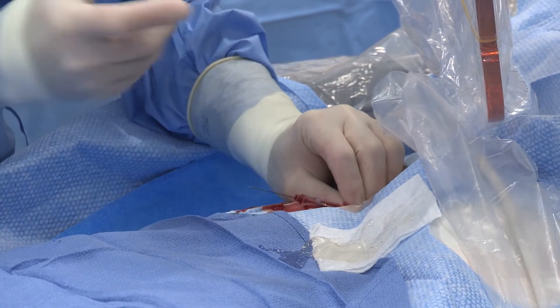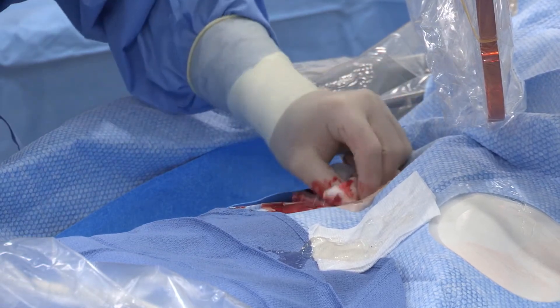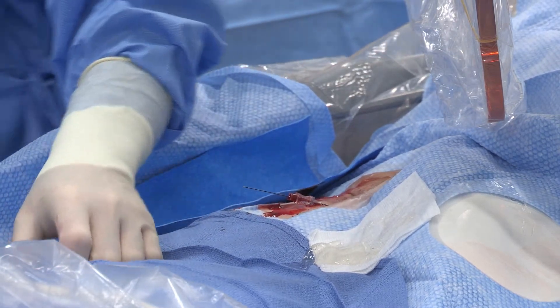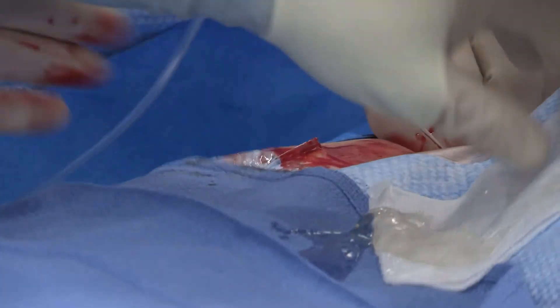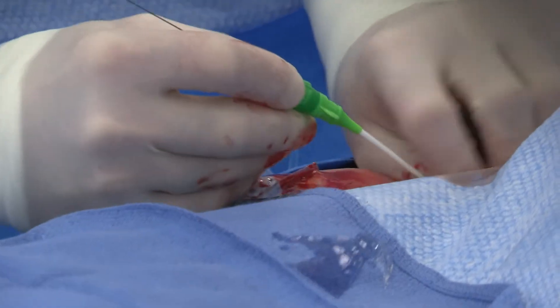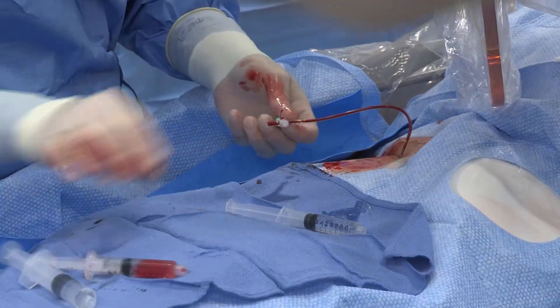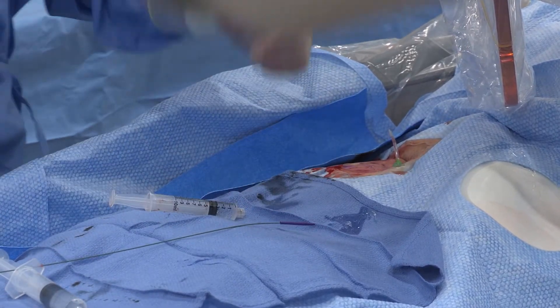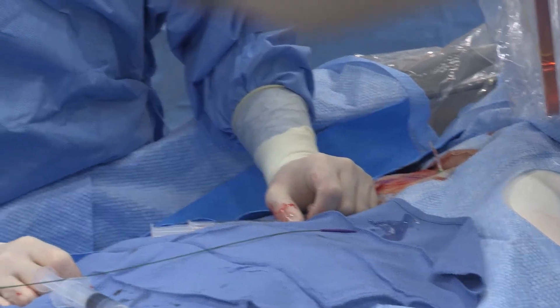I have a good purchase with the wire. You could do a fluoroscopy to identify if your wire is in the right place, but the wire went very smooth and very easily. We're practically done with the ultrasound. I make my nick on the skin, then we're going to place the sheath in. We now have the common femoral artery engaged with a micropuncture 6-French sheath, utilizing ultrasound guidance.